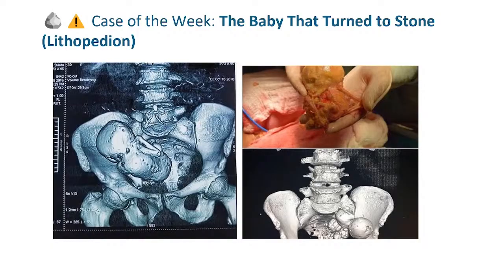So the clinical case: a patient, age 68, gravida 5 para 4, chief complaint chronic low abdominal pain, progressive abdominal fullness, occasional constipation, and difficulty walking due to pelvic discomfort. The history: the patient reported being pregnant approximately 35 years ago while living in a remote rural area with no access to medical care.